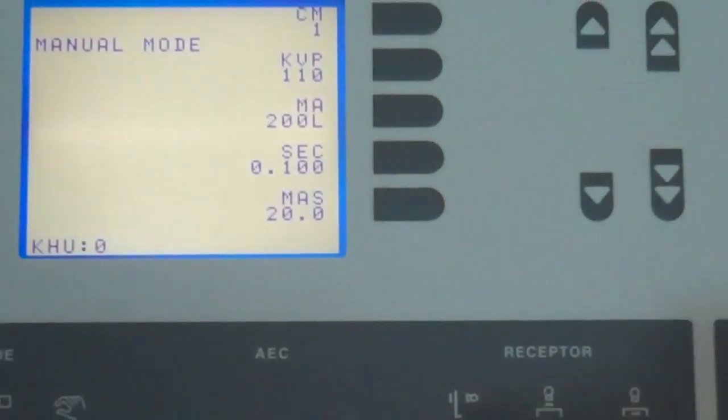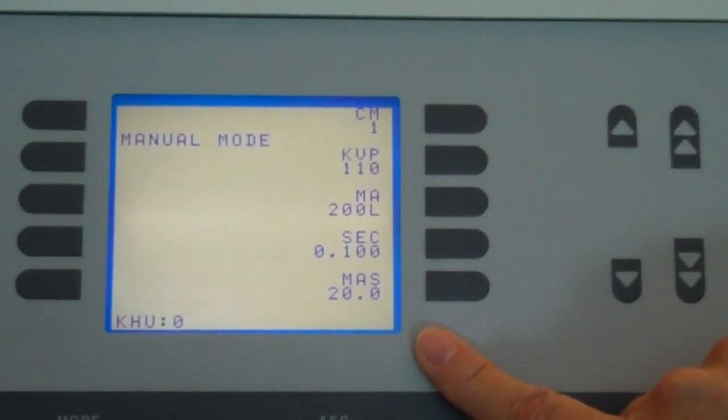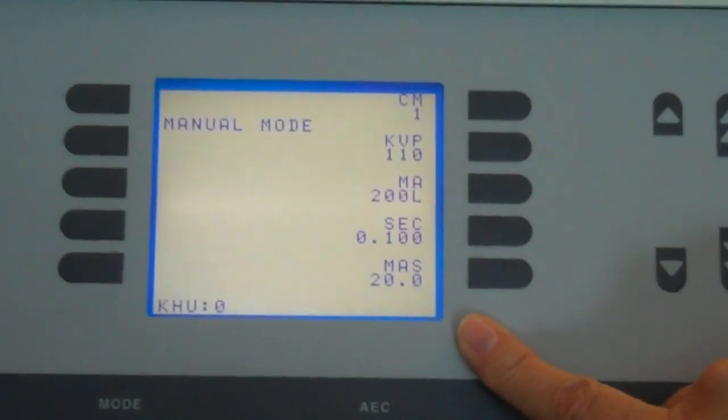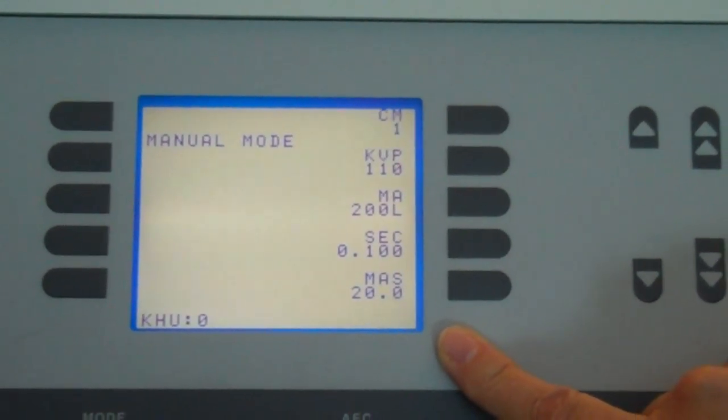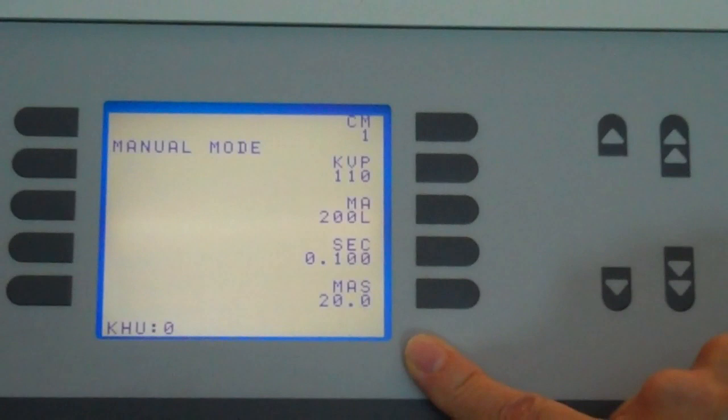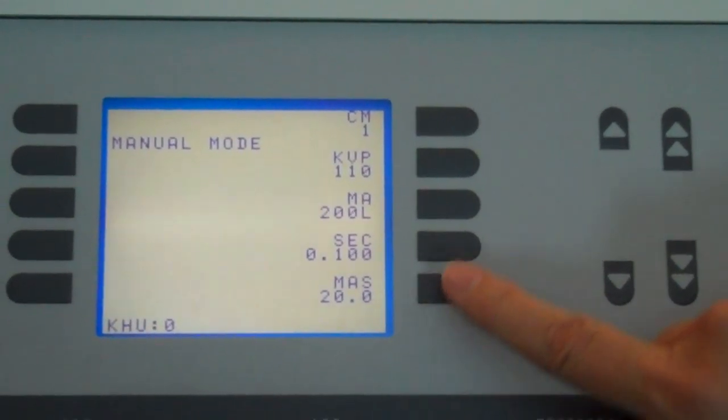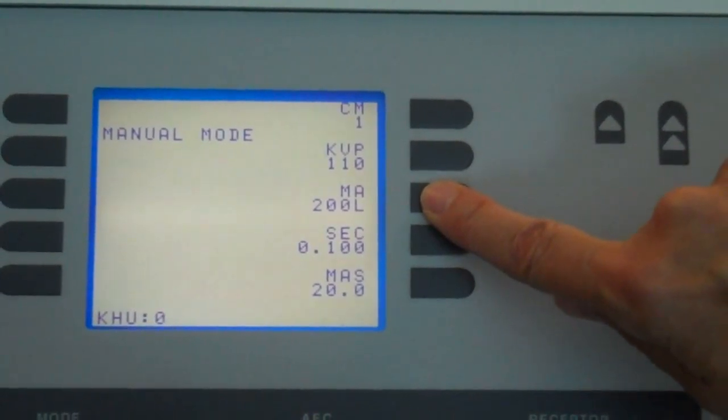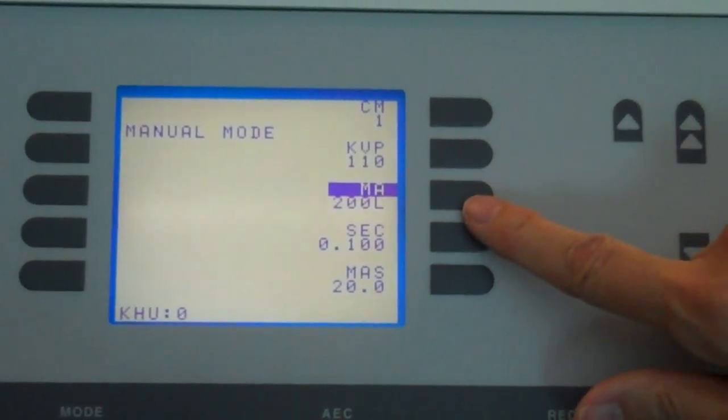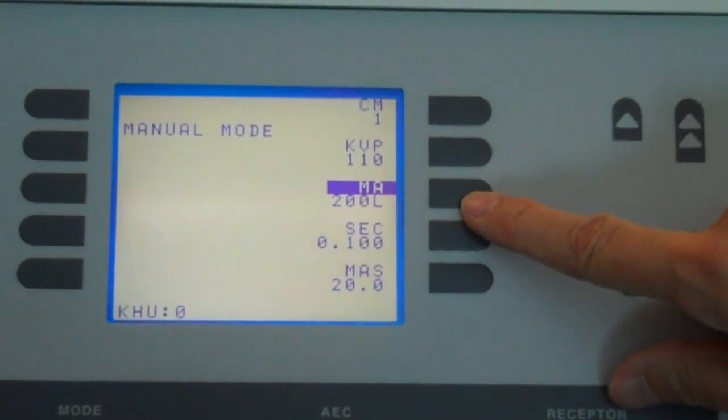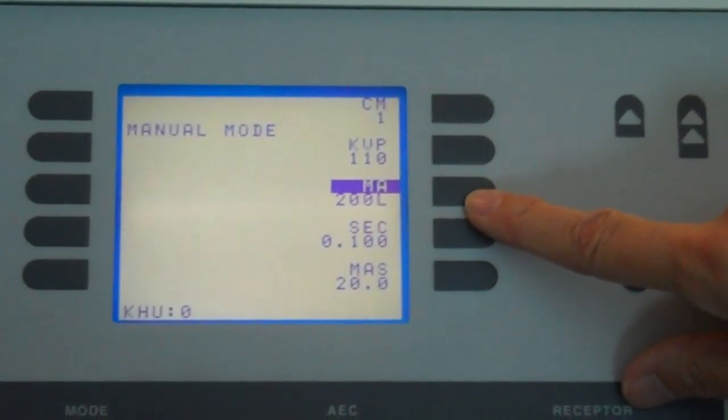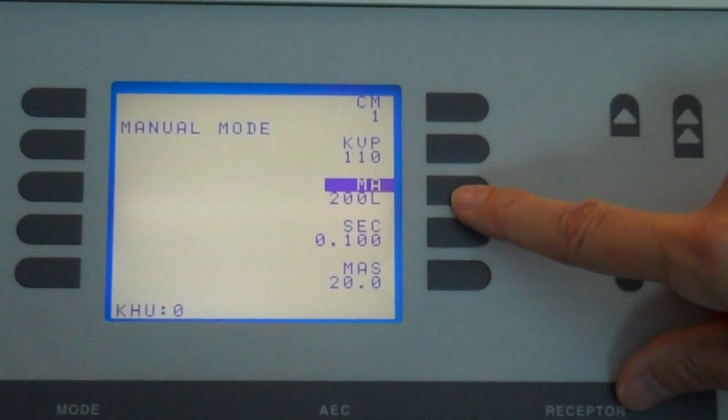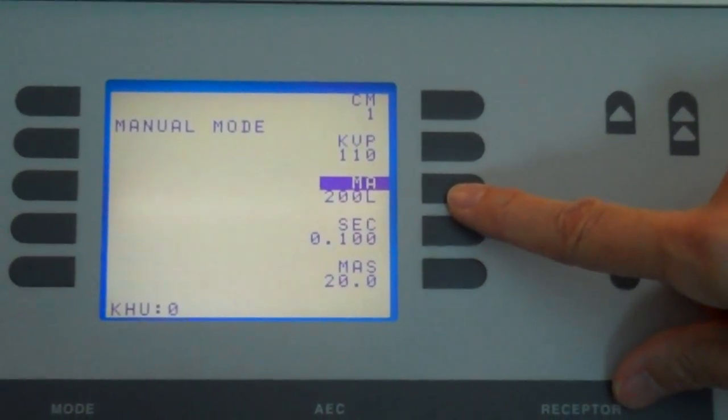Now go to the LCD and you will select the proper KV, MA, and time. If we review, we have selected manual. Now we must make sure that we're on 200 MA. We'll select MA. It tells us it's on 200 already, so you already have selected the correct MA. The L indicates that you do have a large focal spot.